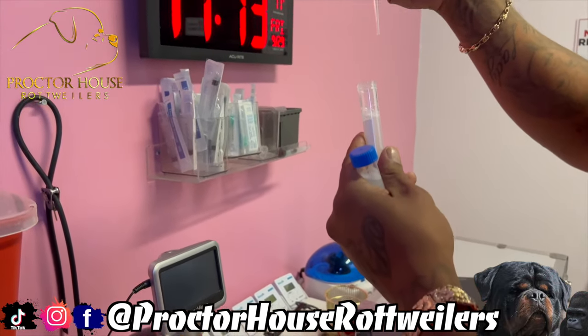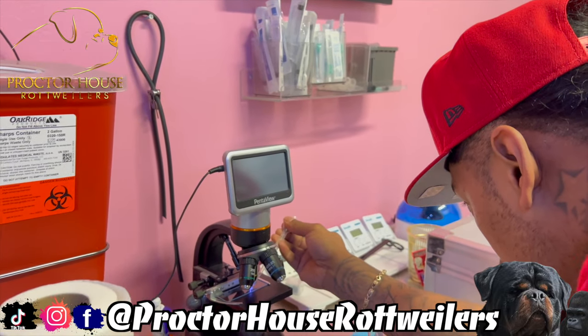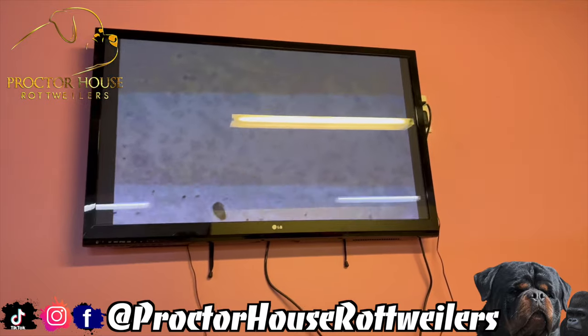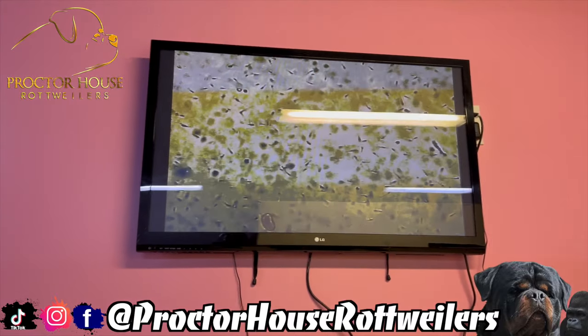Now that we got the semen out of the pack, it's time to put the semen under the microscope to make sure that we actually got some swimmers. Let's see what we got. Keep in mind the semen is still cold, so it still needs to warm up to start moving around a little bit more. But we got swimmers, so we are good to go.